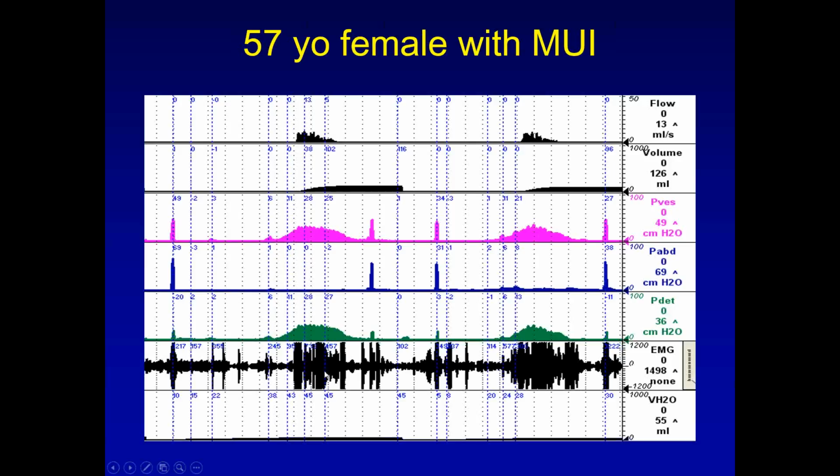Could this be the detrusor sphincter dyssynergia? That's a neurologic process. Well, she doesn't have a neurologic diagnosis, and I doubt it she does. I doubt this is dyssynergia, even though it looks like it. What do patients with bad overactivity tend to do? They tend to squeeze and hold it back down there because they're trying to avoid having an accident. And this is what we call pseudo-dyssynergia. Can you tell for sure?